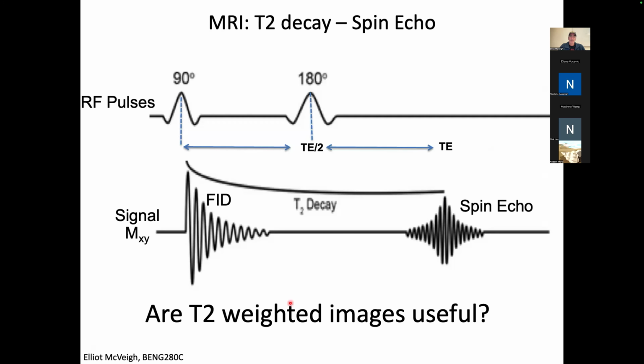So we talked about T1 and T2 time constants. And the question is, if you know the underlying T1 and T2 in a tissue, is that at all useful? Originally, nuclear magnetic resonance, when it was proposed as something to detect cancer, it was thought that what we would do is localize tissue and measure the T1 value and the T2 value, and they would be very specific for different types of cancer. That turned out not to be the case. They are not specific. However, longer T2 and longer T1 often is associated with, say, a lesion like a tumor.